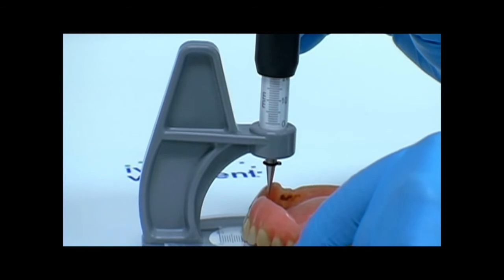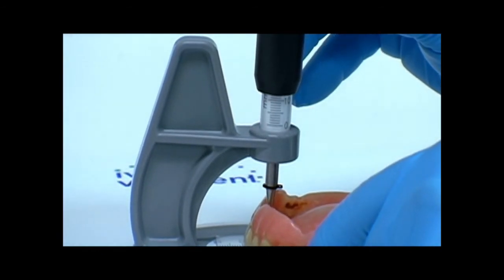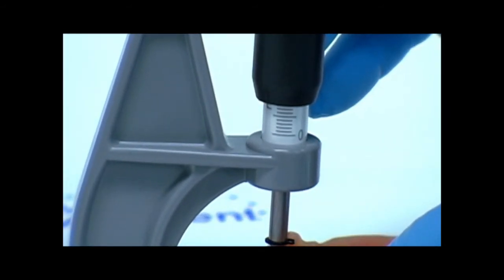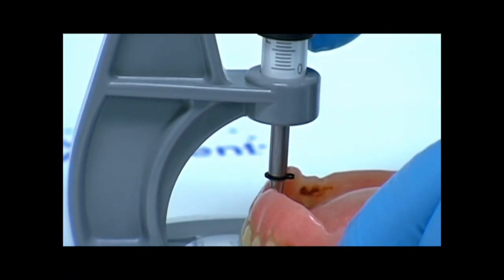And we're going to record, again, communicate some information to the laboratory. I'm going to take this plunger and place it down right into the center of the anterior papilla, which is usually quite noticeable in the patient's denture. And as you can see now, there's a recording. That means from the center of that papilla to the edge of the incisors of the teeth, it measures approximately 8 millimeters.